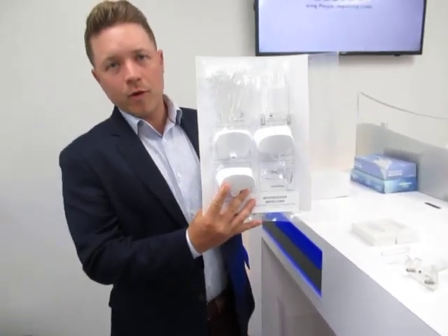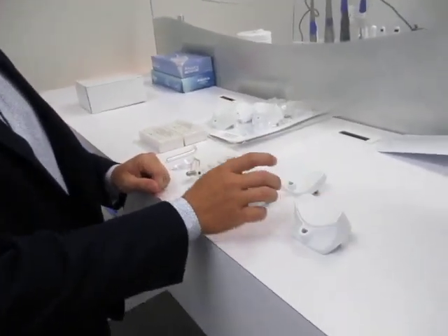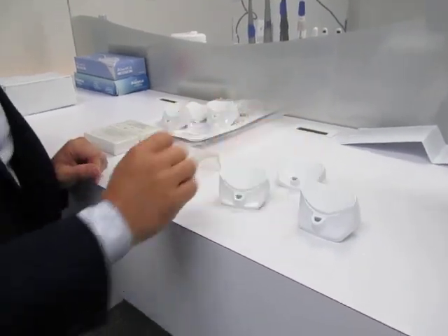This is what it looks like when it comes in the box. It comes with three different chin rests: you have the tall chin rest, the medium chin rest, and the short chin rest. These are going to be used for different exams and we'll go over that in a different video.